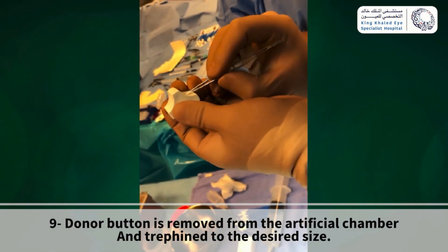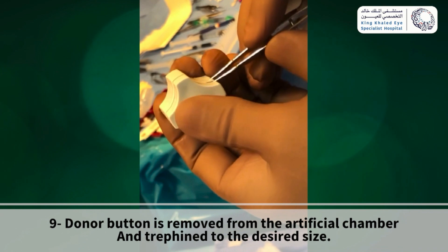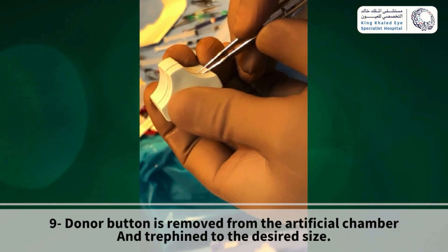Again, use the forceps to grasp the scleral rim and rotate the cornea to make sure that it was evenly trephined across the cornea.